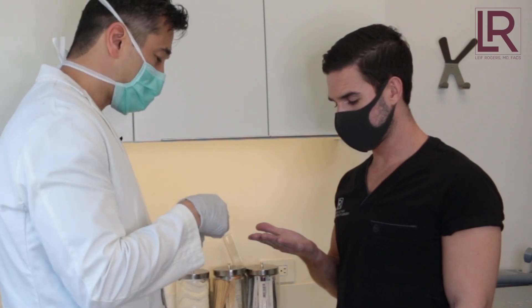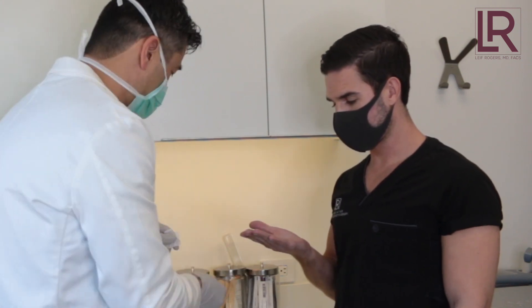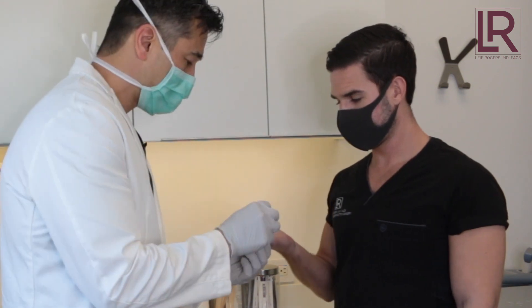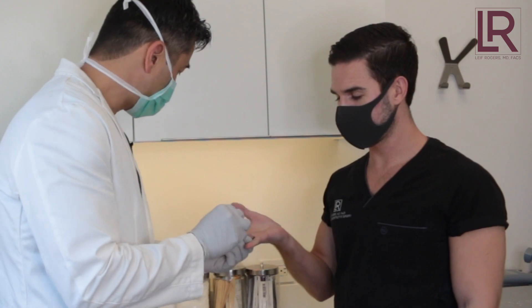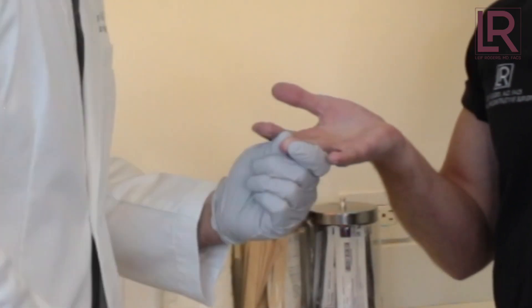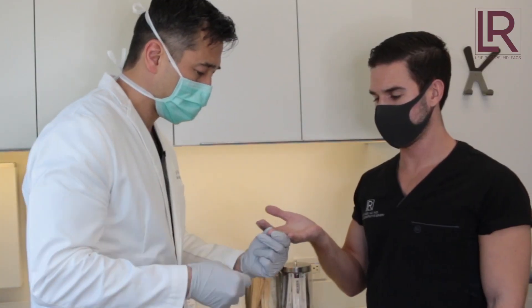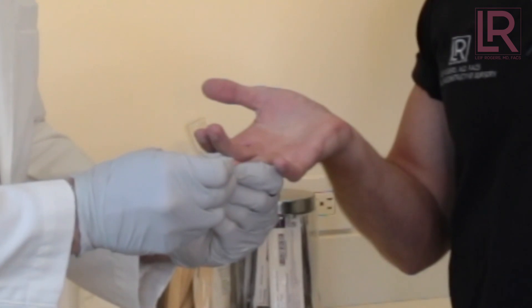Pick a finger you're not going to use regularly — maybe your pinky or something like that. We just wipe it first. The best thing to do is squeeze it kind of tight so you don't feel as much, and you pinch. Then squeeze — see the blood coming out.